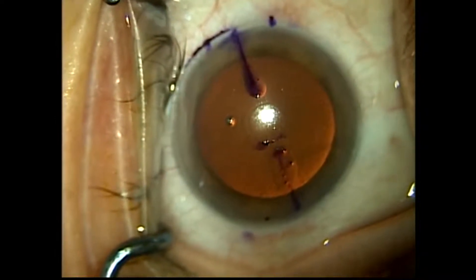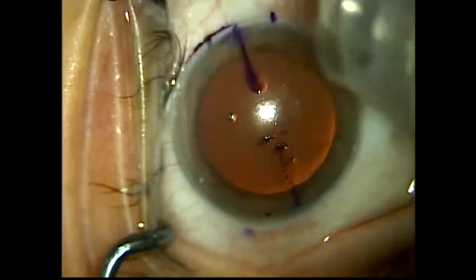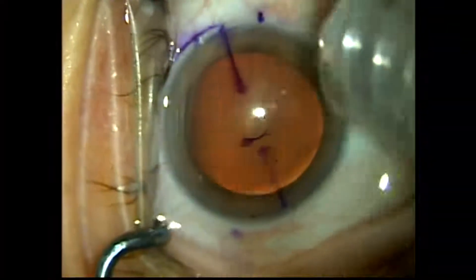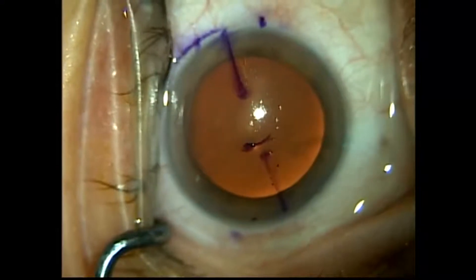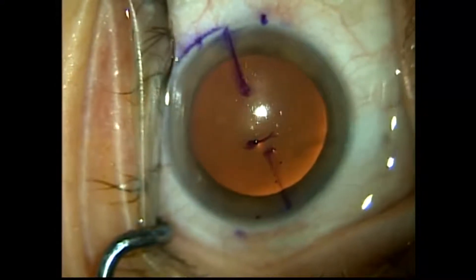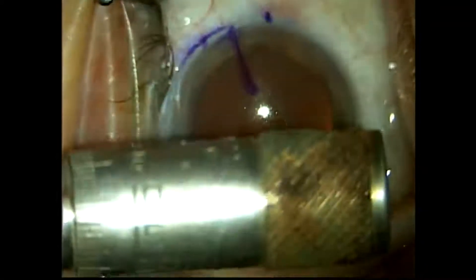We're going to place a crystal lens because the patient desires good far vision and good computer vision. They do not want unwanted nighttime visual artifacts such as halos, and they are willing to wear reading glasses.